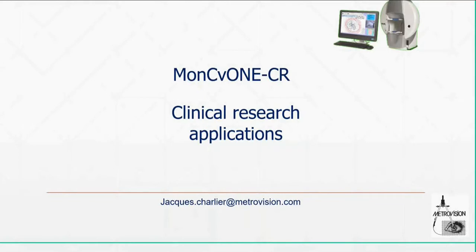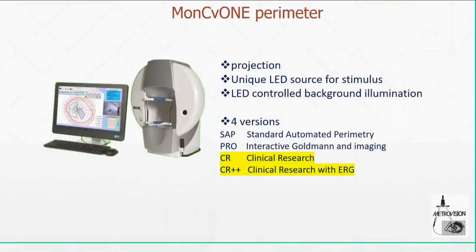Our topic today is the MonCVONE-CR and its clinical research applications. First of all, a few words about MonCVONE-CR and MonCVONE in general. It's a projection perimeter with LED technology for the light source as well as for the background illumination. And actually, it comes in 4 different versions.